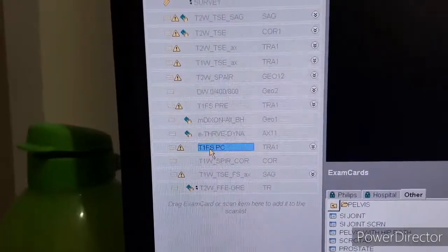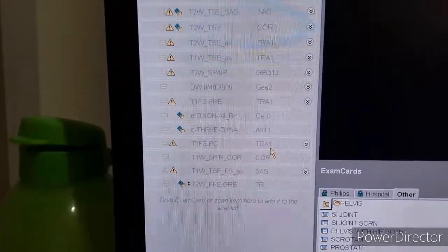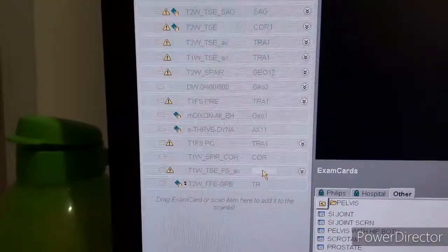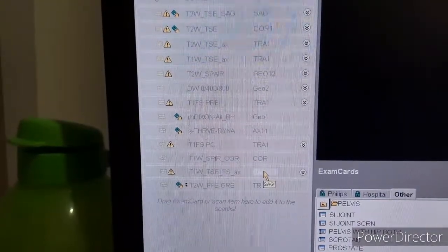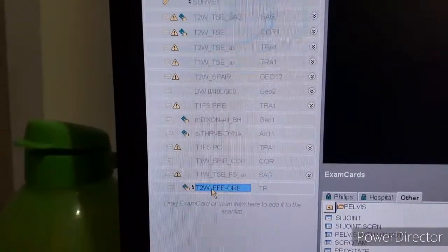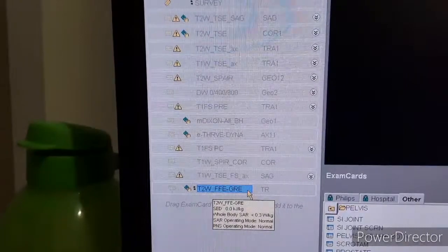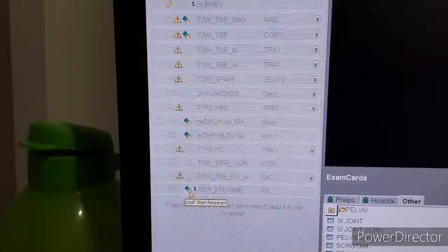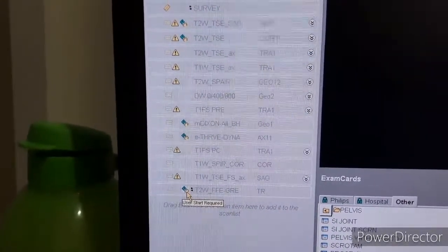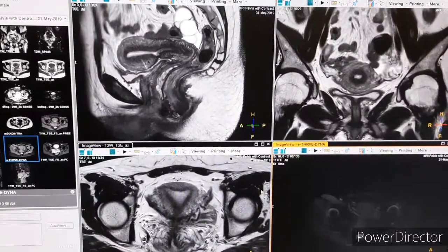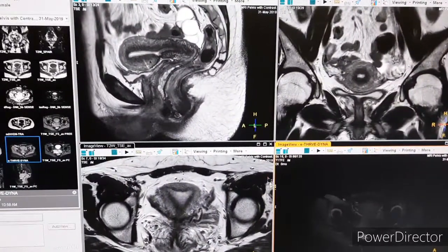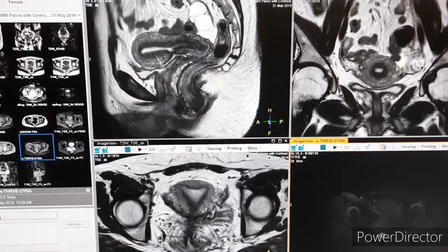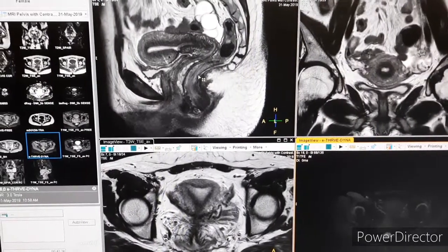After dynamics, we take three-plane post-contrast which is transverse, coronal, and sagittal. The gradient sequence is optional, that is why we have kept it as a pause. Now let's come to the planning — how do we plan.